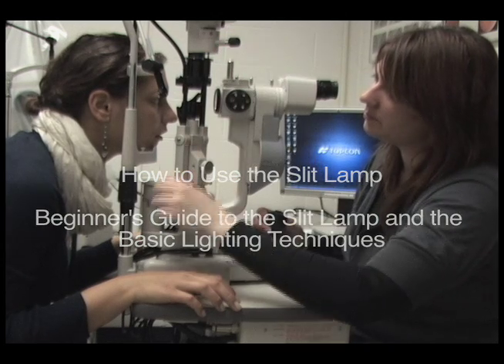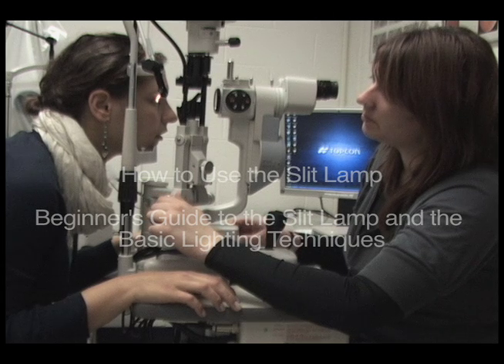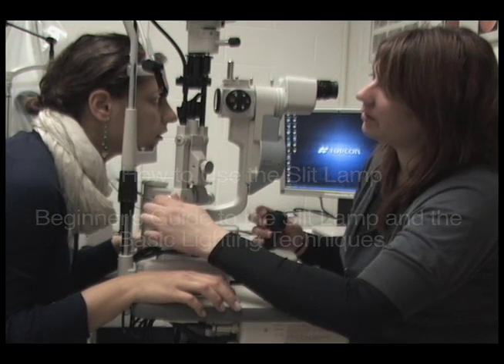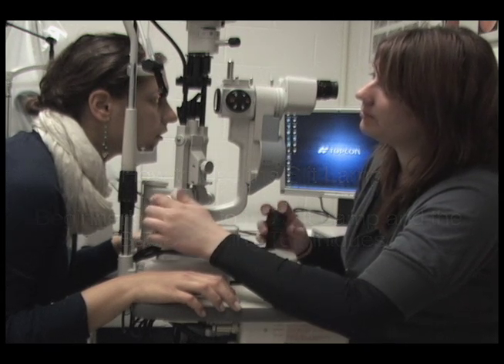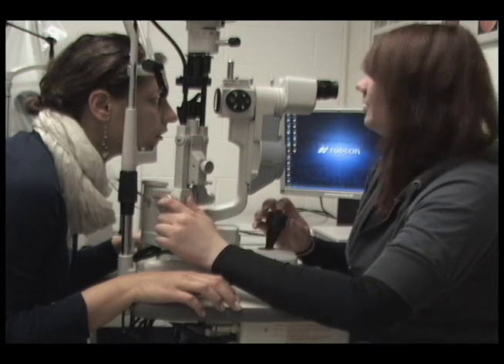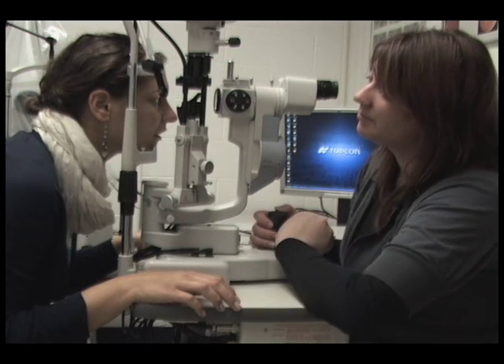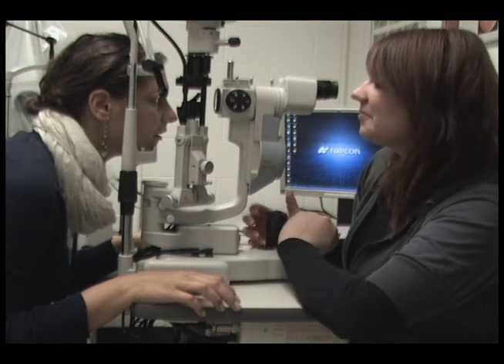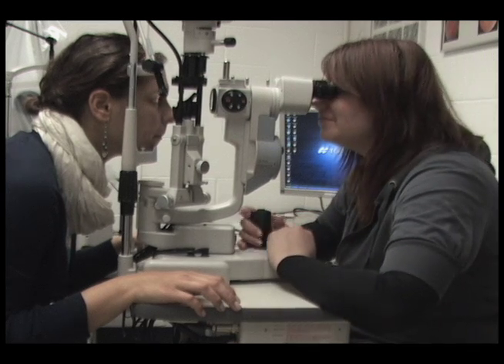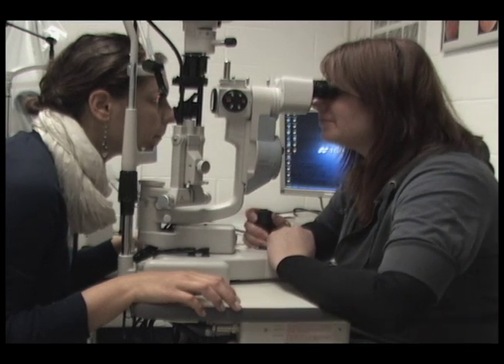According to Professor Christy Sisson, the slit lamp is one of the most challenging aspects of ophthalmic photography, but it can also be one of the most fun. This is due to the level of control you as a photographer have over the quality, direction, and size of the light.